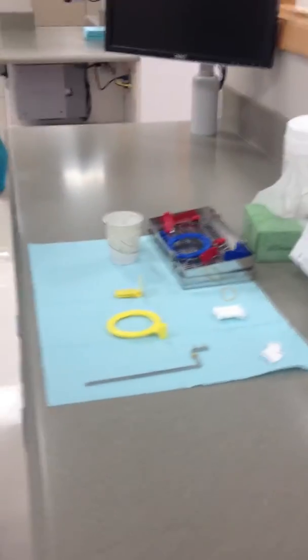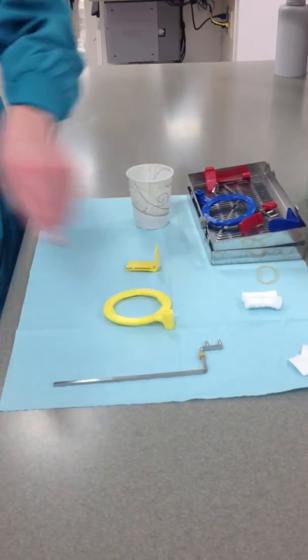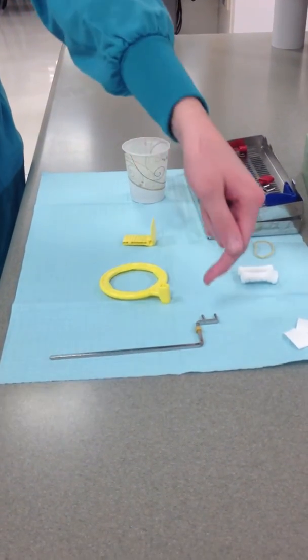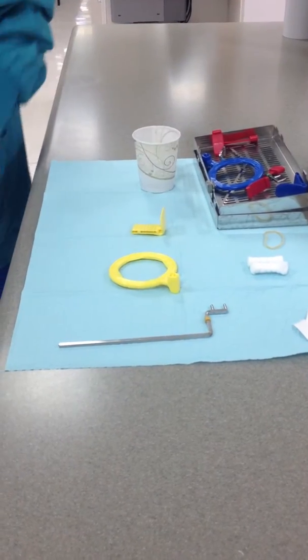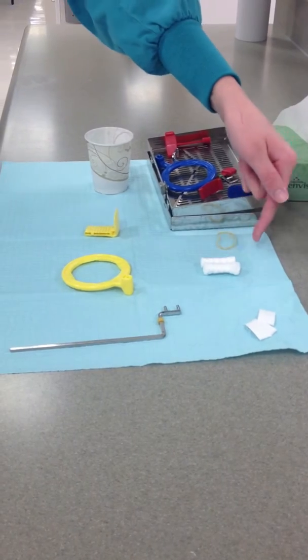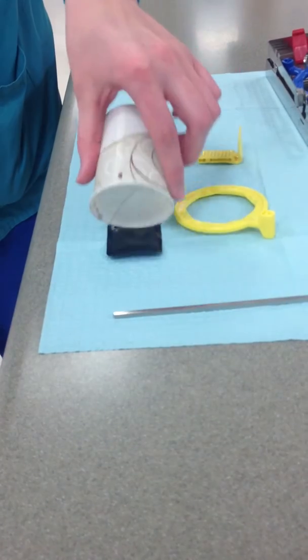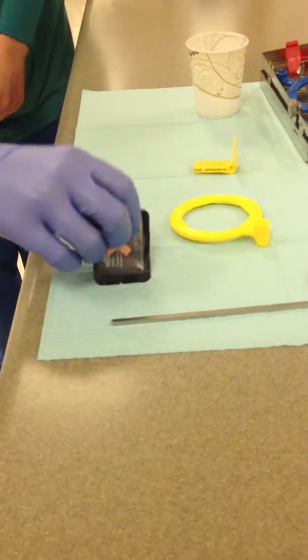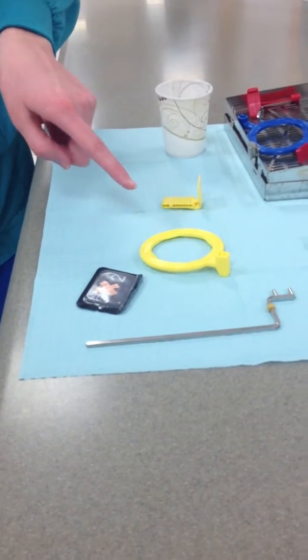Open the cassette. The items you will need to take the radiograph are a film holder device — the one you will be using today will be the one with the yellow rubber band that sits flat on the table — a bite block, which should be yellow, cotton rolls and rubber bands, film size number 2, and a ring, yellow, with the one we will use today being slightly offset.